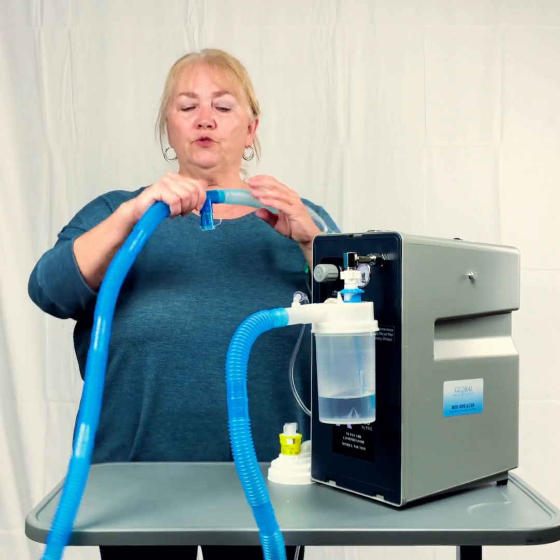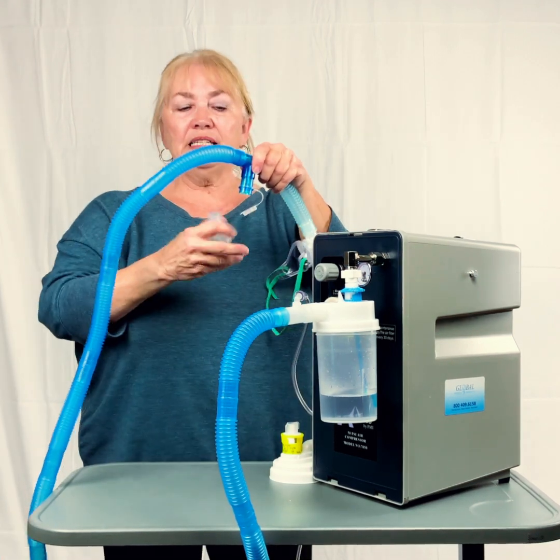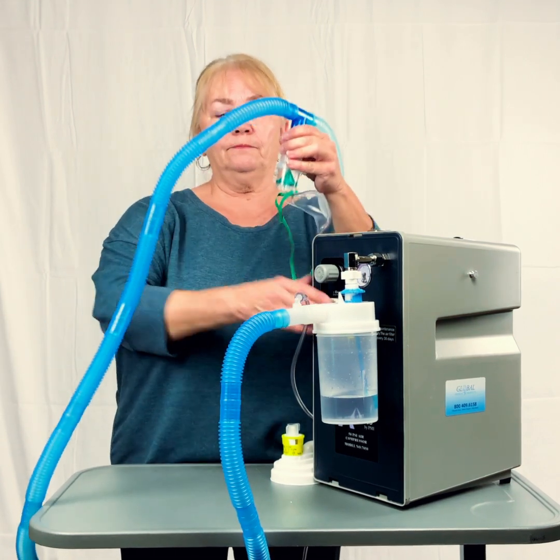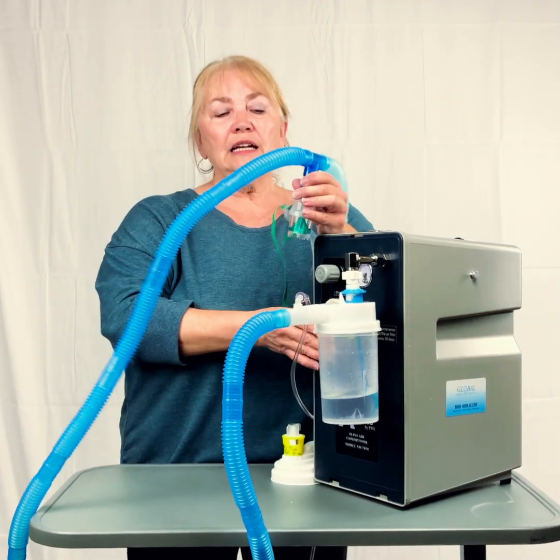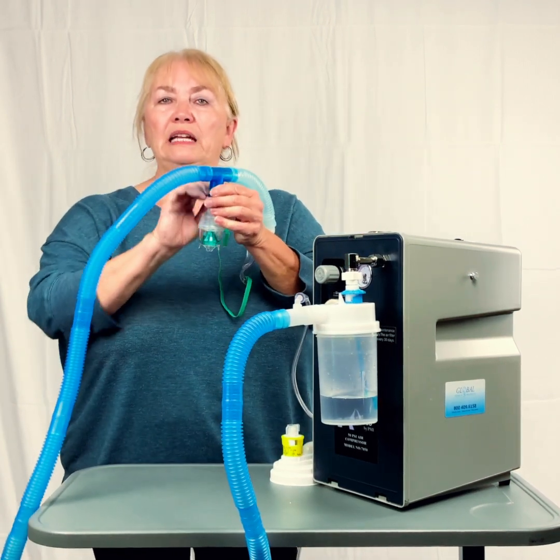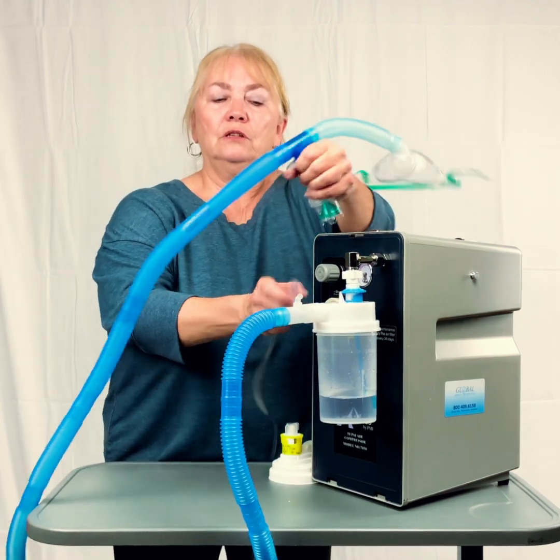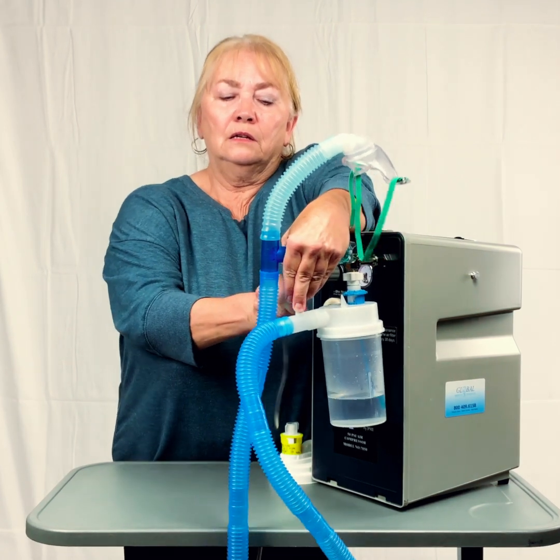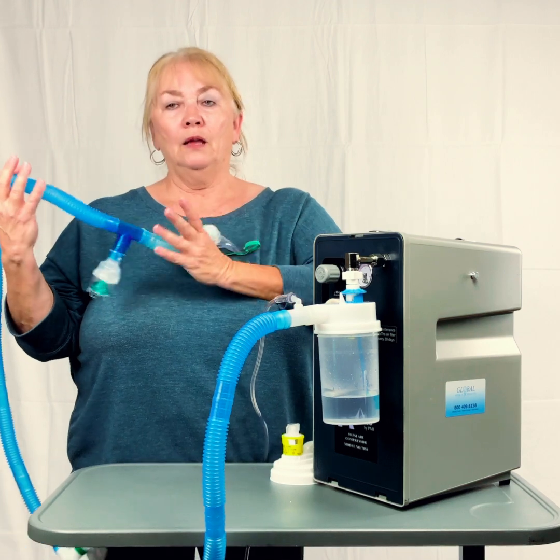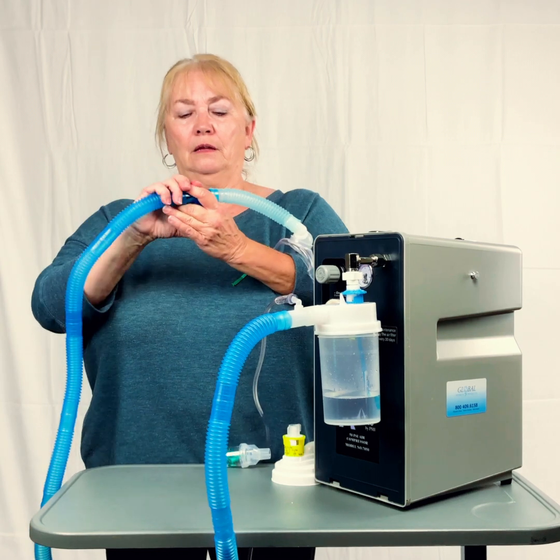If we're doing a breathing treatment, then you uncap this, your medicine cup hooks to the bottom, your tubing goes to your nebulizer machine, you turn on the nebulizer, you turn this machine off. So all they're getting is their medication, is what they're breathing. If they're on oxygen, they're still getting their oxygen through the tubing to the mask. But now they can get their aerosol treatment. When the aerosol treatment is done, you take the medicine cup off, you cap it.